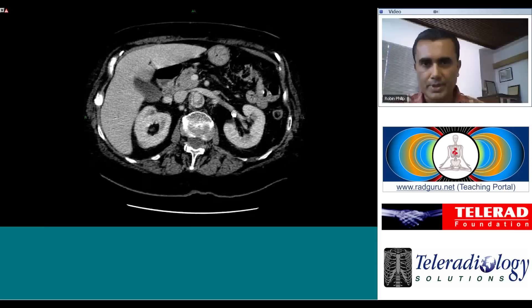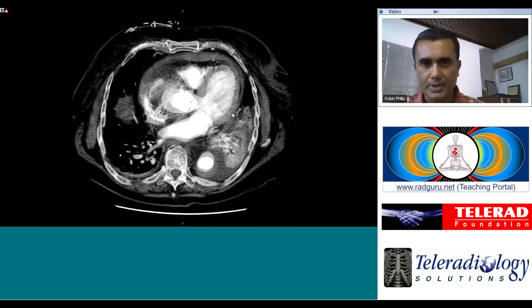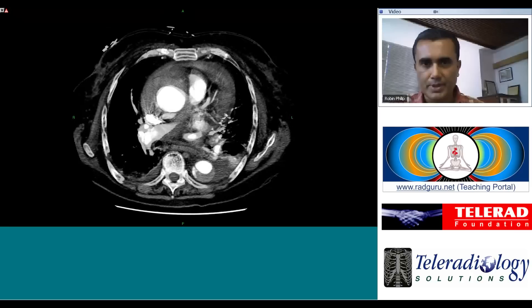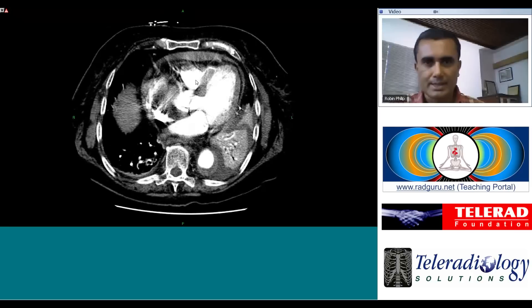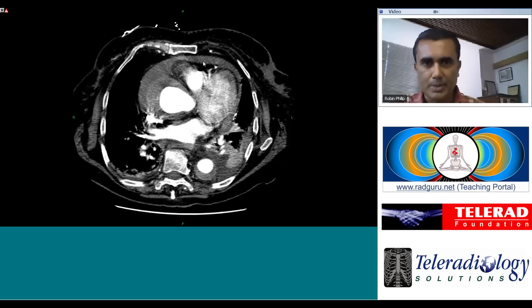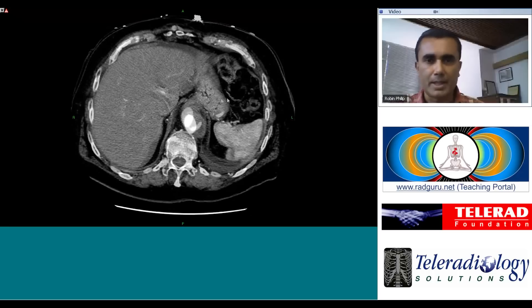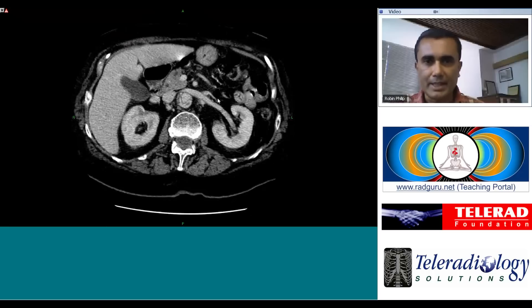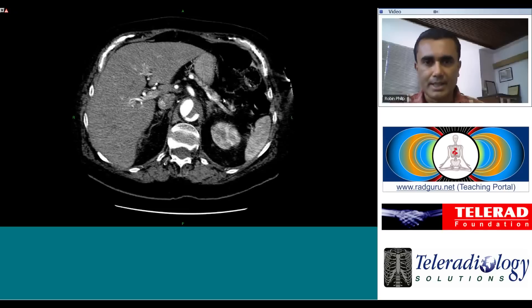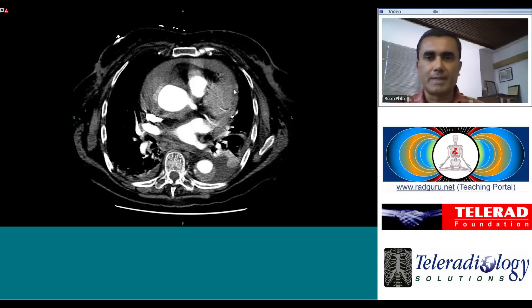So that covers the extent of the dissection. Then we go back and look for complications. The complication that is apparent on this scan is that the dissection has leaked into the pericardial space — we can see high density fluid within the pericardial space in the form of hemopericardium. This is a leaking aortic dissection, and if left untreated it could potentially result in tamponade and death.